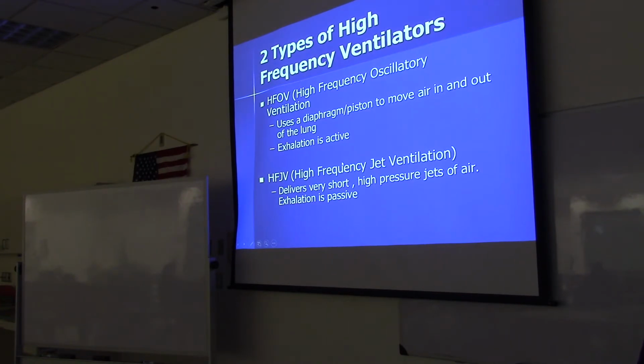And then with high frequency jet ventilation, it delivers very short, high pressure jets of air, and exhalation is passive. There's nothing pulling the air back out. So you've got the jet vent just delivering jets of air, and exhalation occurs at the same time as inspiration.